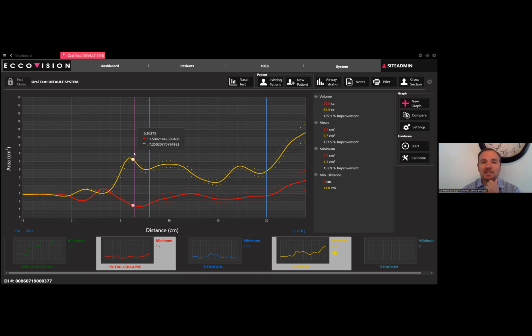If you want to save yourself time and frustration, start down the track of these being custom-made oral appliances that are just for you early in that conversation. If you're guessing at this, which is what we call the GG, the George gauge or guessing gauge, you're going to have good results half the time, but you're never going to know when it's going to happen. And then you're going to see them in a month and you're going to jack their jaw forward, and then you're going to see them in a month and ask them if they're still snoring.